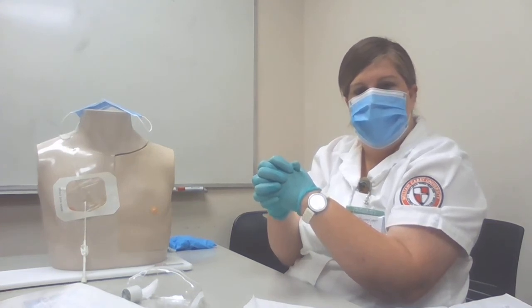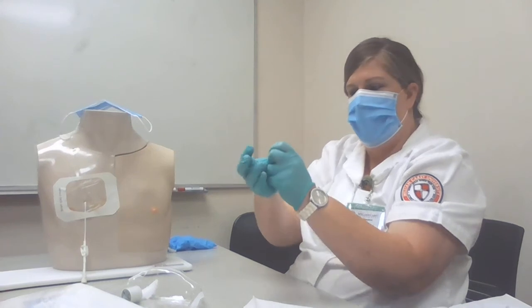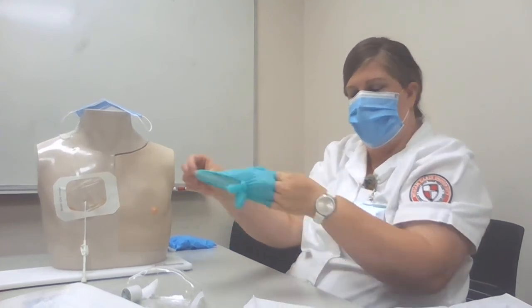Next I would remove my sterile gloves and discard them into a biohazard bag. I'd wash my hands. I'd document the patient's response, the dressing change, and any signs of infection, like any redness, swelling, bleeding, or bruising.